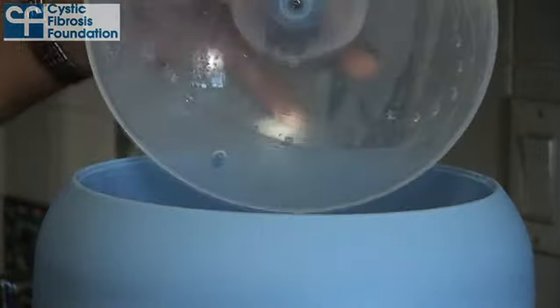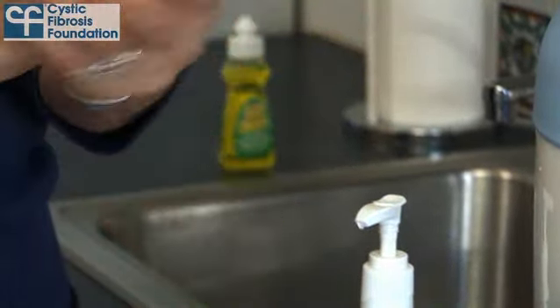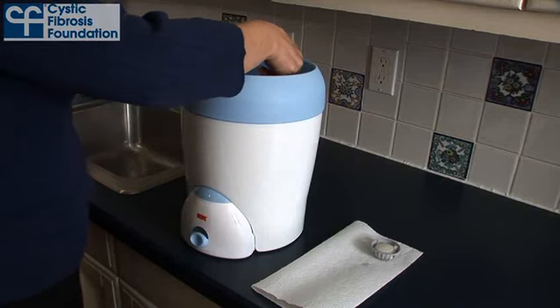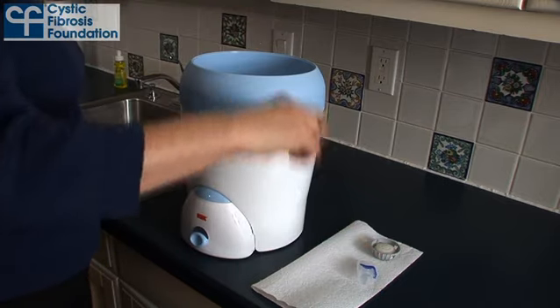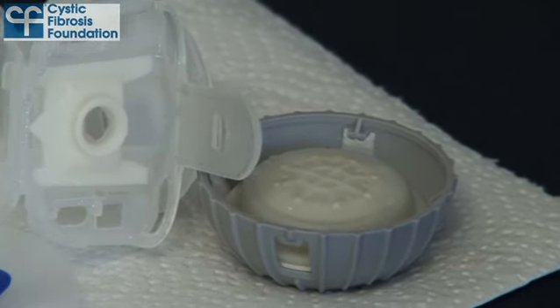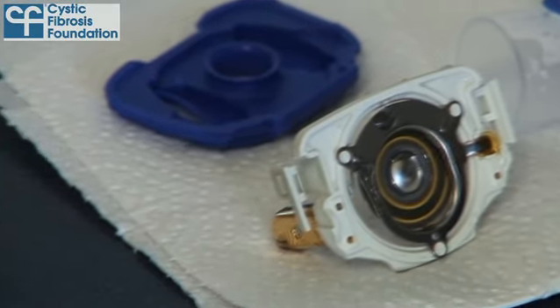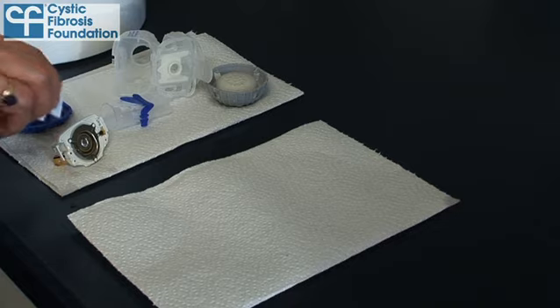Once it's finished, wait at least 3 minutes before opening the sterilizer or you could be scalded by trapped steam. Before handling any of the disinfected items, remember to clean your hands with alcohol-based hand gel or soap and water. The items will be very hot, so allow them to cool down or use tongs to remove them from the steam sterilizer. Place the handset parts on a clean lint-free towel or paper towel to allow them to air dry. If the towels become damp, replace them with dry ones.